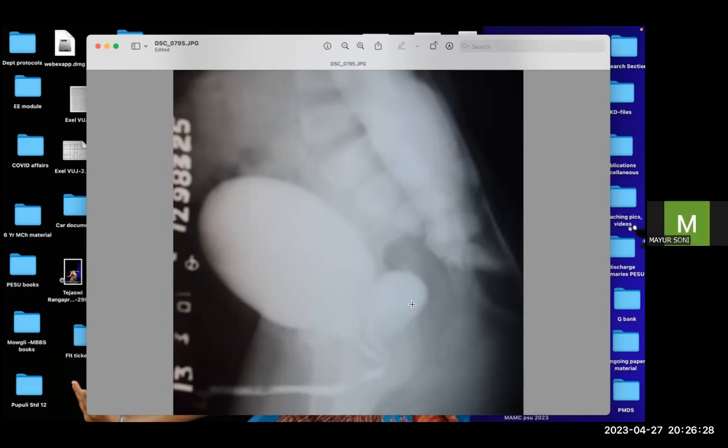Then I will see the uterine musculature. But how can you see that on the surface? You can only see the surface. What is another thing you might see on the surface, jutting in, which will tell you that there is probably a uterus, which sometimes you might see in the contrast study also at that area?